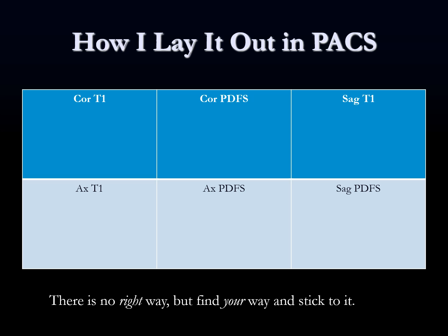This is how I lay out the images in PACS most of the time. I like to have coronal images at the top left, axial images at the bottom left, and sagittal images towards the side — on a multi-monitor setup with a 4x4 configuration. The other part of the monitor can be used for comparison. My advice is to find what works for you and be consistent about it every time.